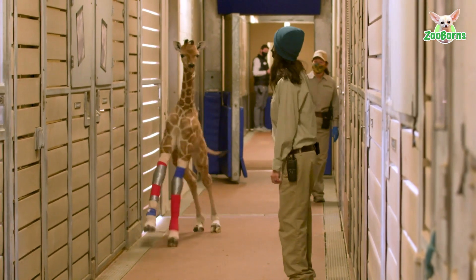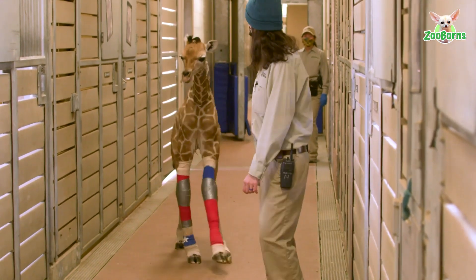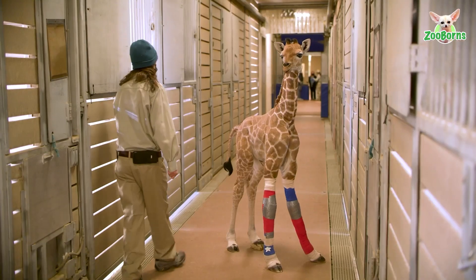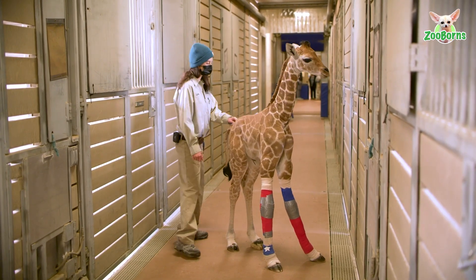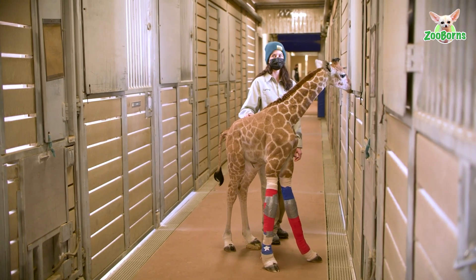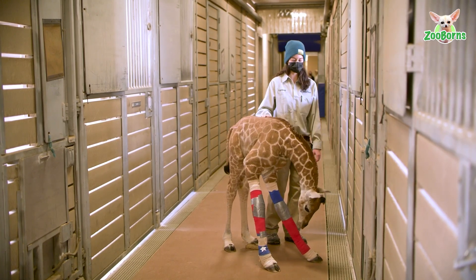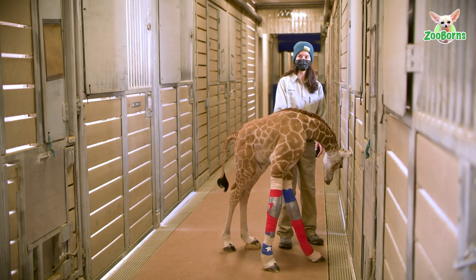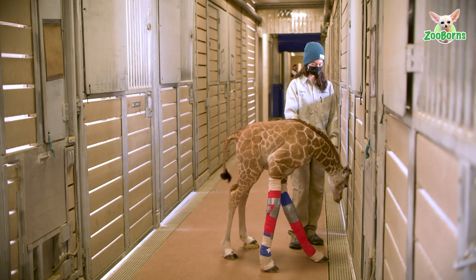We casted this giraffe initially because we didn't have braces on hand to prevent further hyperextension. But it did not help because she was unable to flex that joint. It's important for a giraffe to build up the muscles and strengthen the tendons and ligaments through flexion and extension. When you're casted, you're completely immobile and can't go through range of motion. So casting was fine as an immediate fix to prevent her from going back even further, but long term we had to look at another solution — and that's where the braces came in.